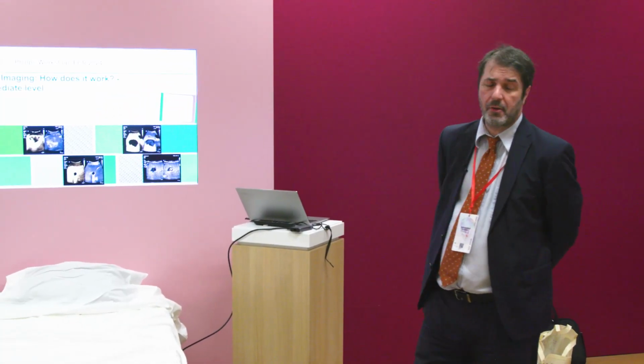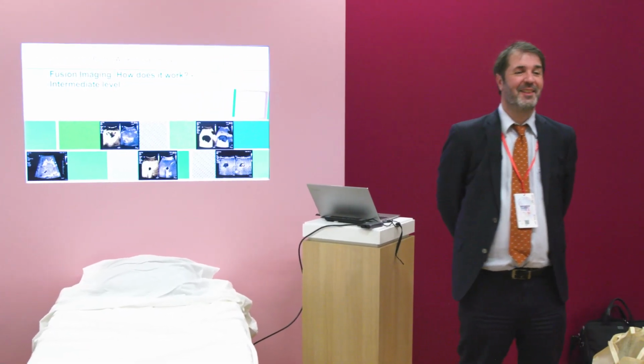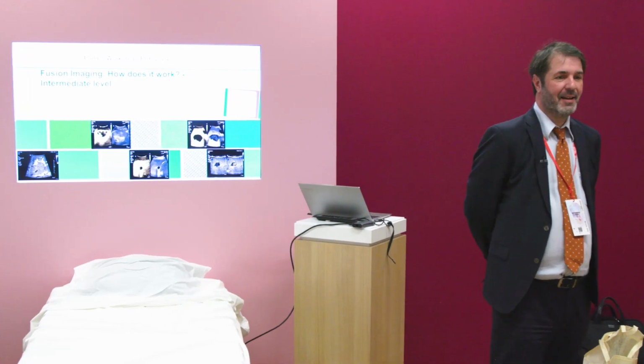And the first question is, do you have any experience regarding fusion? Not at all. Student in biomedical engineering. Oh, okay. That's not too bad. So then we go very deep into how it's working.